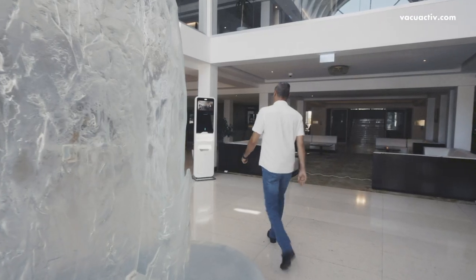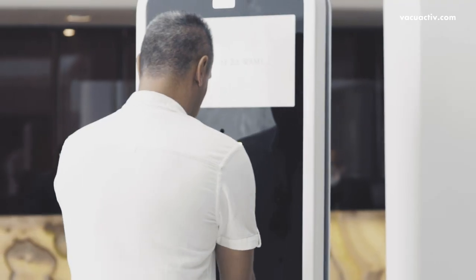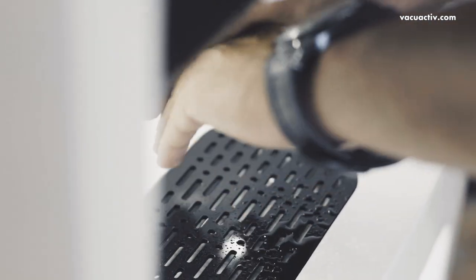This is Sanitique — temperature body control and automatic dispenser for hand disinfectant with multimedia kiosk station.